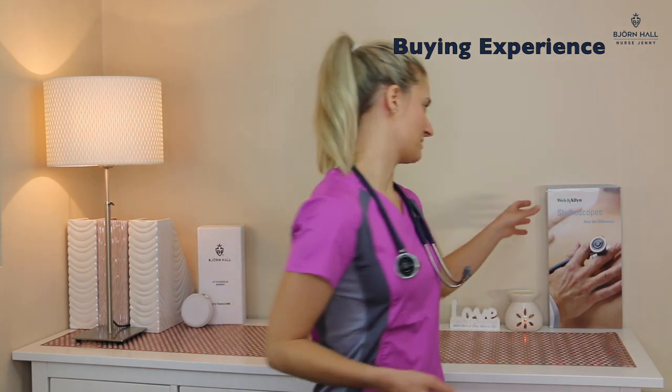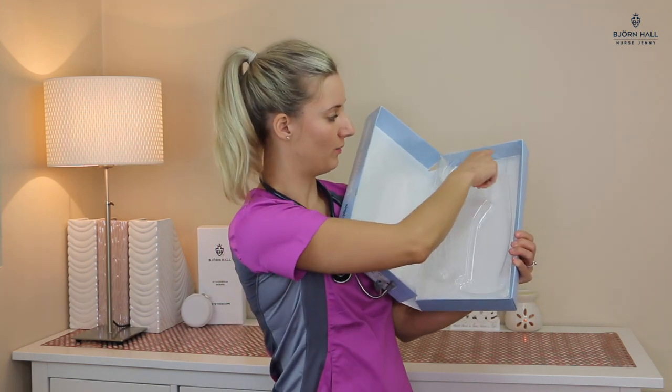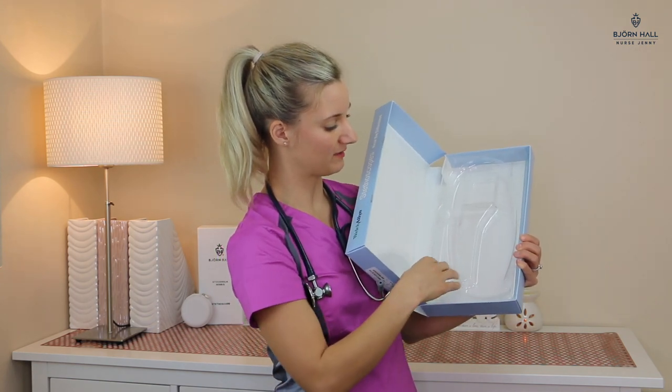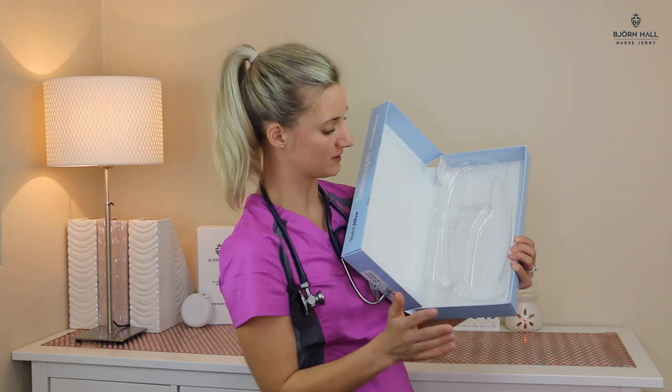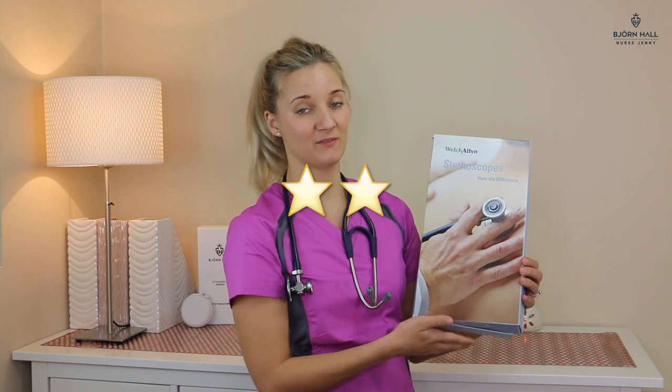Warranty. In the user manual it states that you get a five year warranty with this stethoscope, but after researching this on the internet it says you get a 10 year warranty. I'm going to base it on the warranty in my user manual when I bought the stethoscope, so for that reason I've given it a four out of five. Buying experience. I received this stethoscope in a box, and opening it up there's a section where the CD goes and the spare kit sits in there. The user manual doesn't actually have a spot that fits in here at all — it just sits on top and falls out when you open the box. For the money that I paid, I would have thought I would have gotten something of better quality, so I've given it a two out of five.